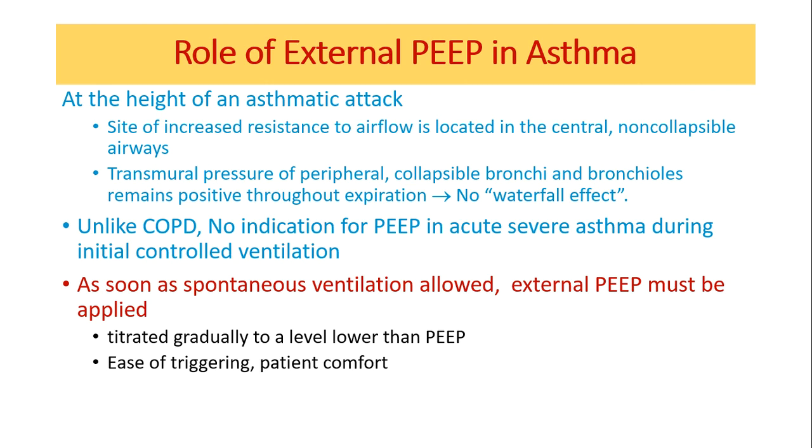When you talk about COPD, it has this constant collapse throughout, whether the patient is totally controlled or breathing spontaneously. Remember that. So some amount of PEEP is always given in COPD even after intubation. But the major role of PEEP, measurement of auto PEEP and everything, comes when doing weaning. In asthma, you can start with 0 PEEP when you initially intubate the patient. At the time of weaning, you can give a very slight amount of PEEP, mainly to help the trigger work of breathing. Okay.